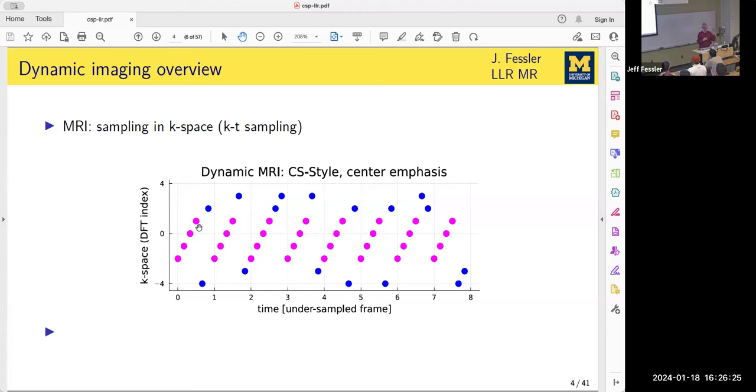I've talked about the trade-off between spatial resolution and temporal resolution, but there's another trade-off involved in this, which is volume coverage. If I'm willing to look at just one slice of the brain, then I can get a decent trade-off between spatial resolution and temporal resolution. But if I want to look at the whole brain, then it takes more time, right? So for answering a question like how do we know if it's fast enough, we can study just part of the body and see what the time constants are. And then from that, get a sense of what temporal resolution we need when we're trying to image the whole brain or the whole heart or whatever, or the whole gut, as is paying the bills for some of us right now. That's a very qualitative answer to your question, but I think the fact that we can look at limited fields of view can help us answer that question.